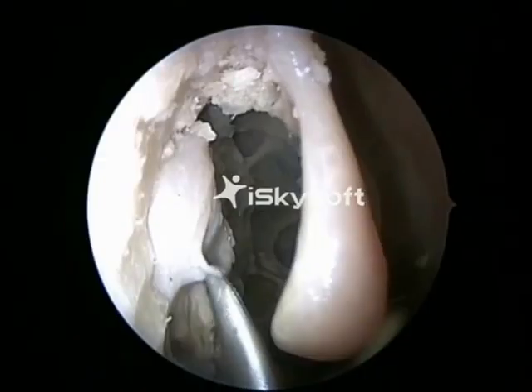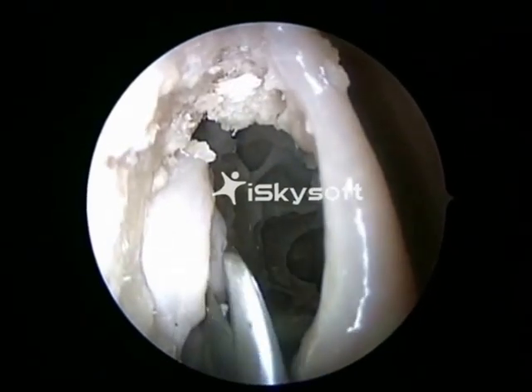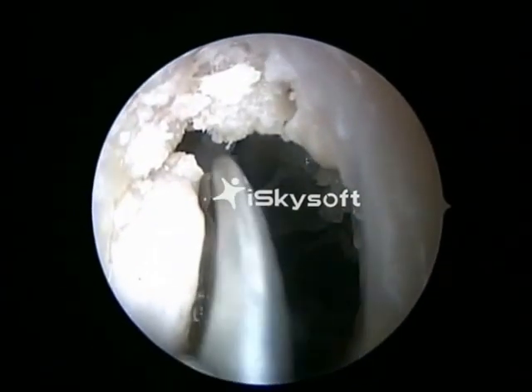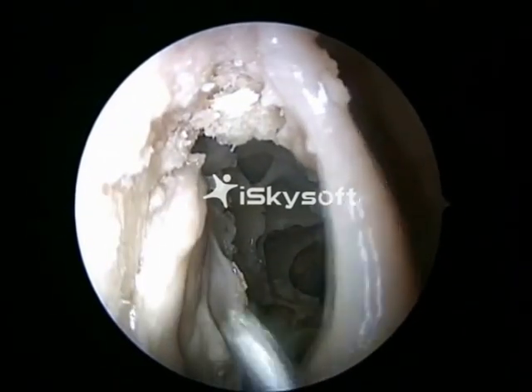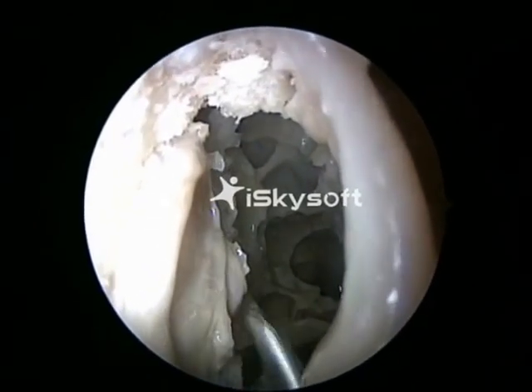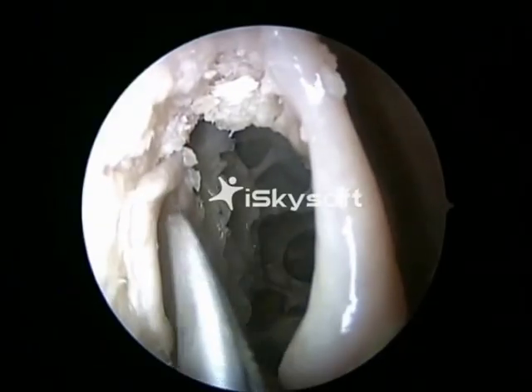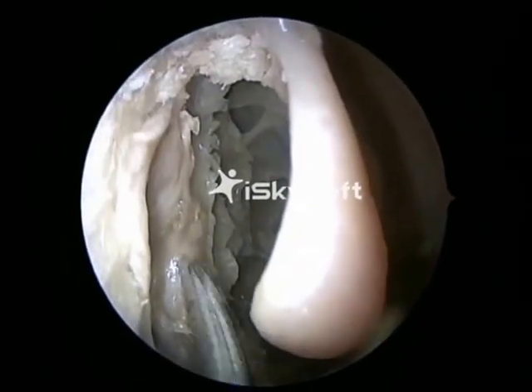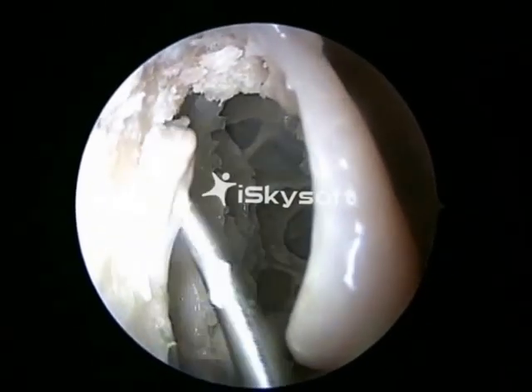The next step would be to use the upturned scissors to create two flaps, the anterior flap and a posterior flap. These flaps are draped over the bone in such a way that the whole of the medial wall has been fully exposed. And the two flaps are in contact with the mucosal surfaces, which are going to be repositioned.